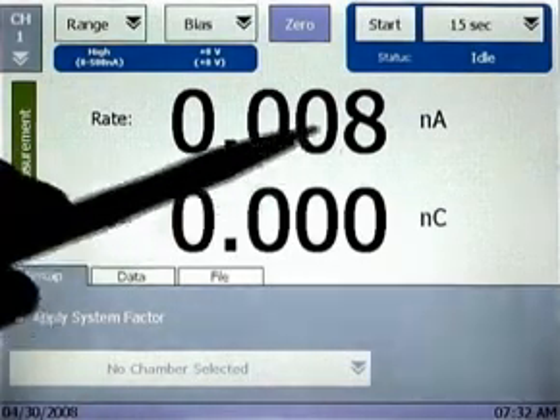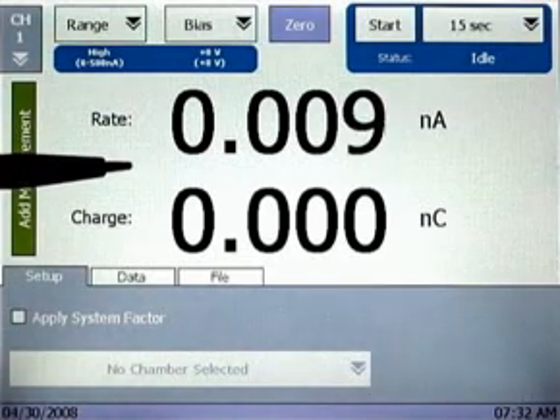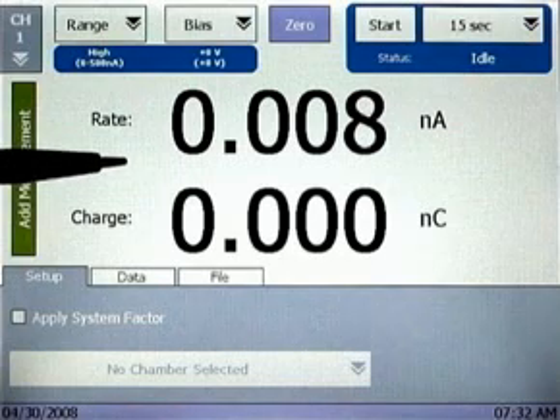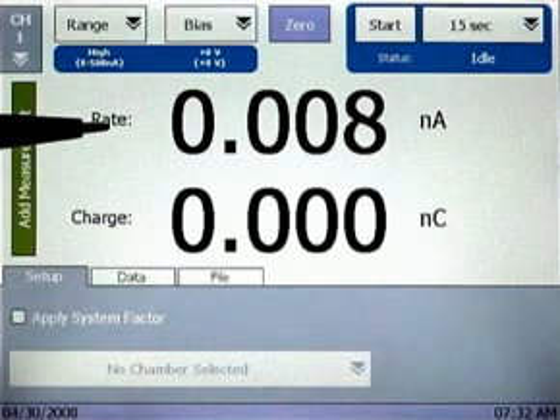Along the top of the screen are the basic electrometer measurement parameters. First, the range setting. The SuperMax operates on a high range of 0–500 nanoamps, or a low range of 0–500 picoamps. To choose the current operating range, just tap the range pull-down menu and select high or low.